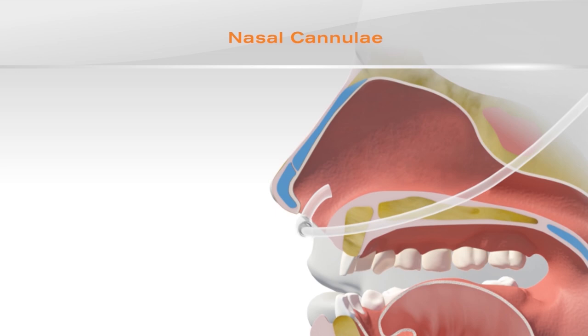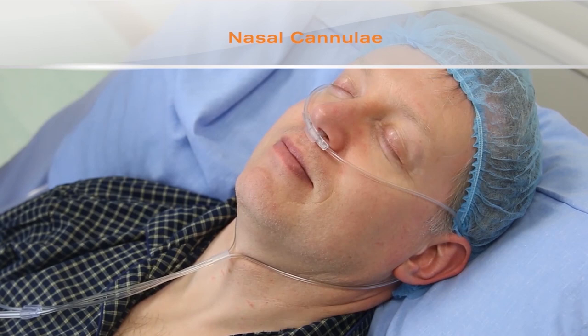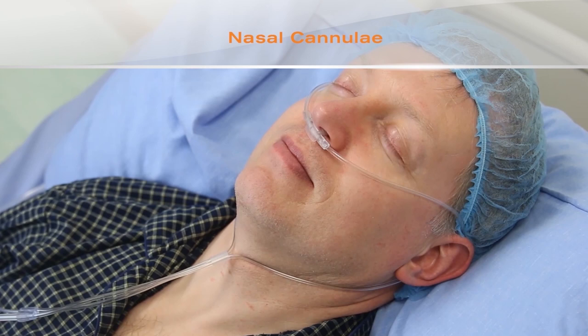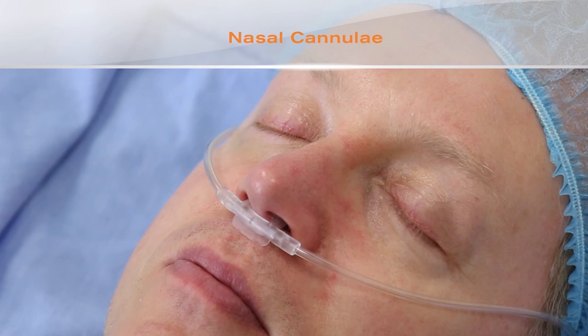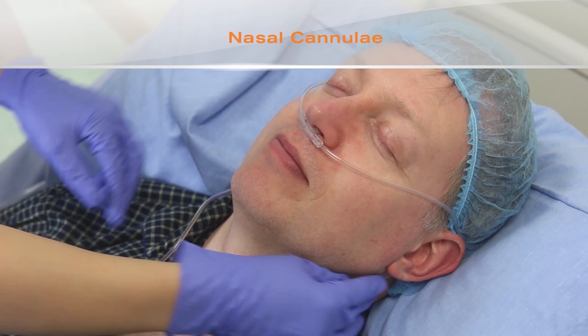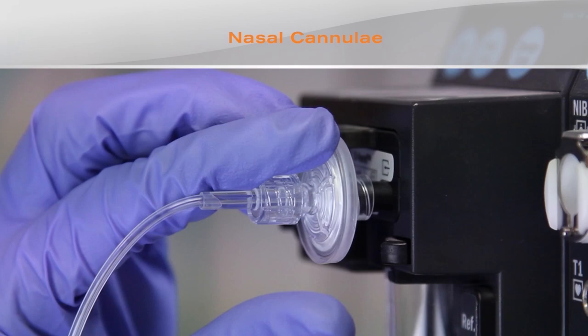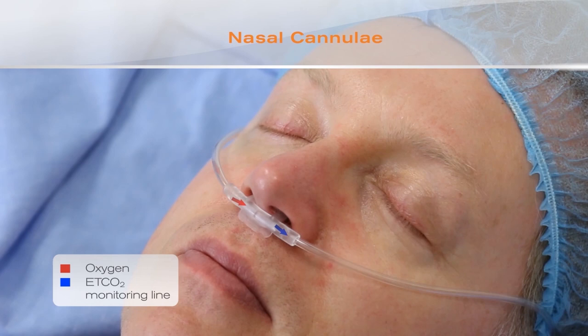Nasal cannulae can be supplied with ear guards, which can benefit long-term users by preventing sores on and around the ears. Nasal cannulae are also available which allow sampling of exhaled carbon dioxide in non-intubated patients. The Intersurgical devices with this feature are called the Sentry nasal cannula, which are suitable for patients undergoing conscious sedation where respiratory depression needs to be monitored. The Sentry nasal cannula allows delivery of oxygen through one nasal prong and sampling of exhaled gas through the other prong, and the end tidal CO2 values are comparable to those achieved with intubated patients.